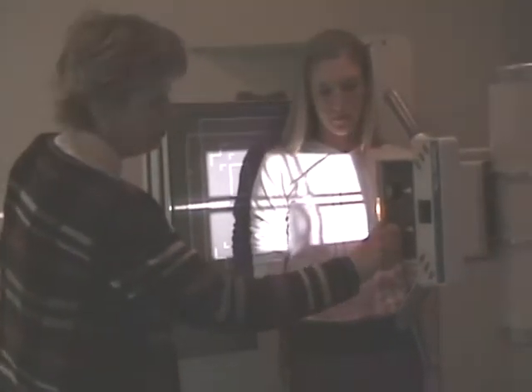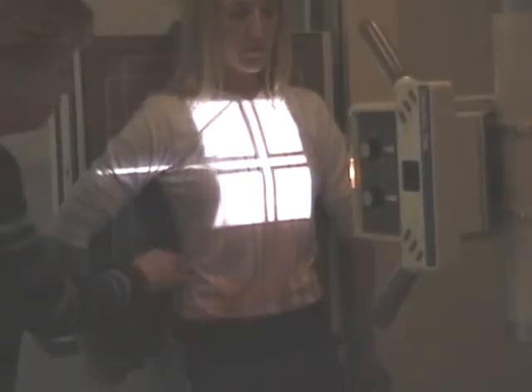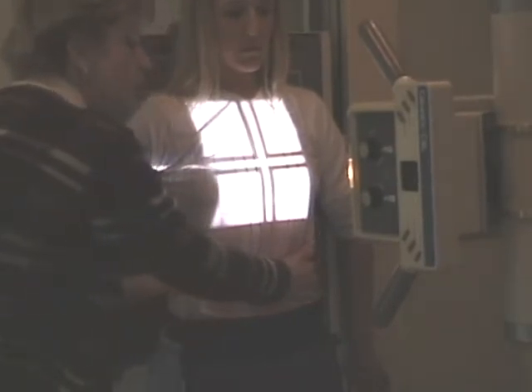Change my collimation to 10 by 12. And now I'm after the below diaphragm ribs. So I'm going to find your iliac crest, and while I'm palpating the iliac crest, I can feel her lower ribs, and her crest and her lower ribs are fairly close together.